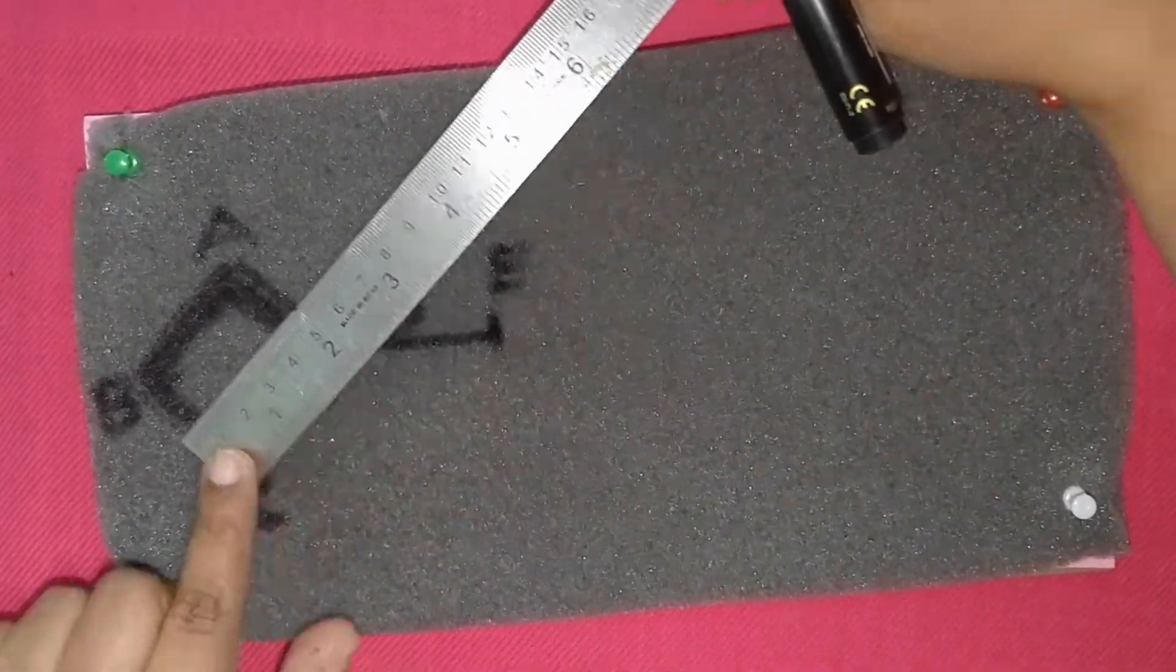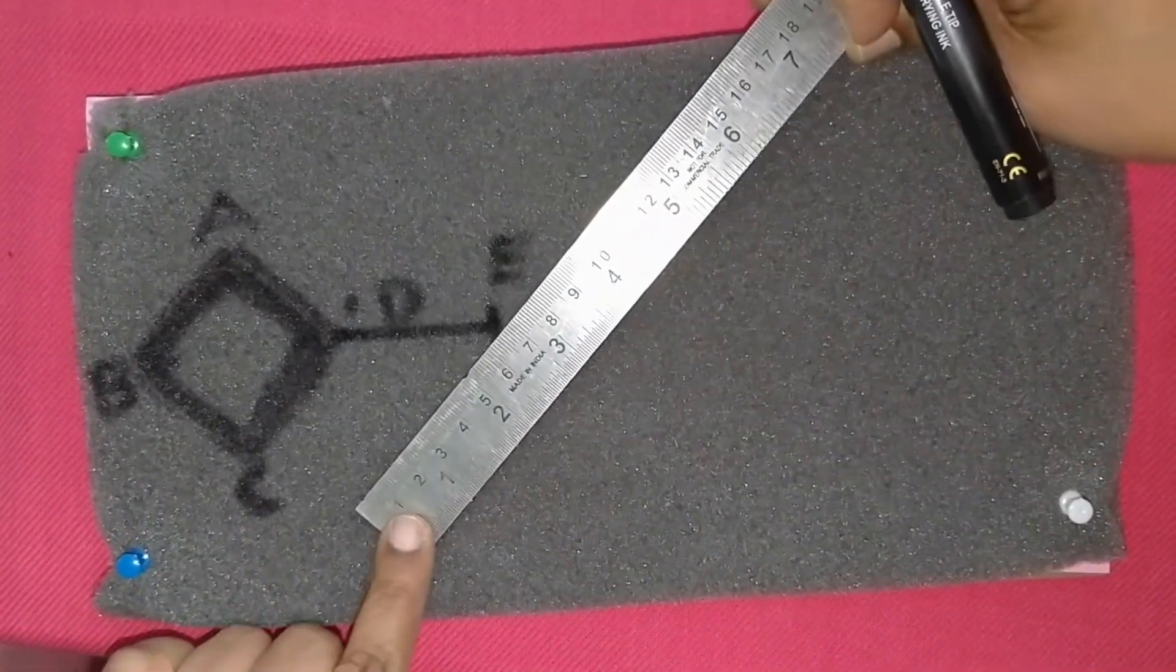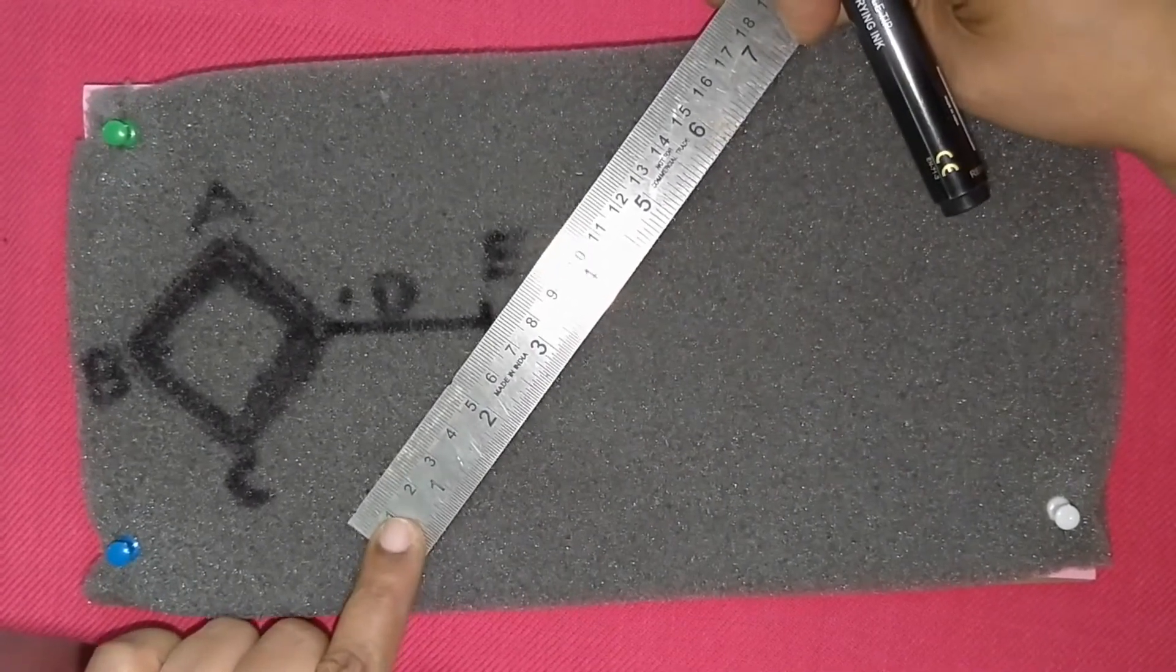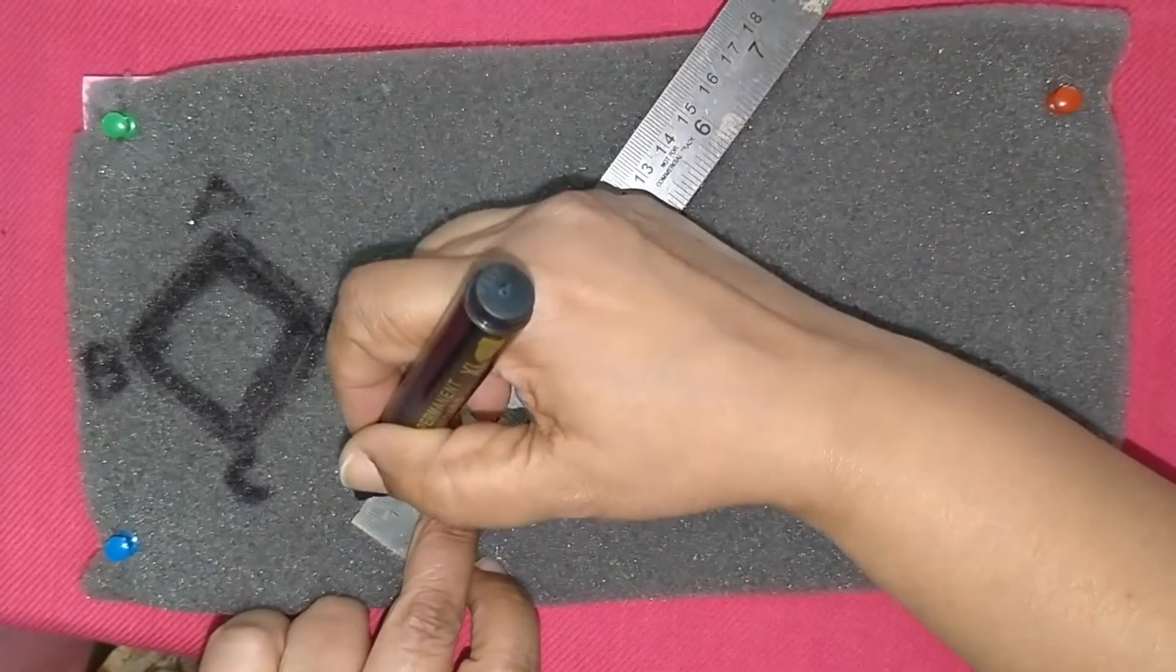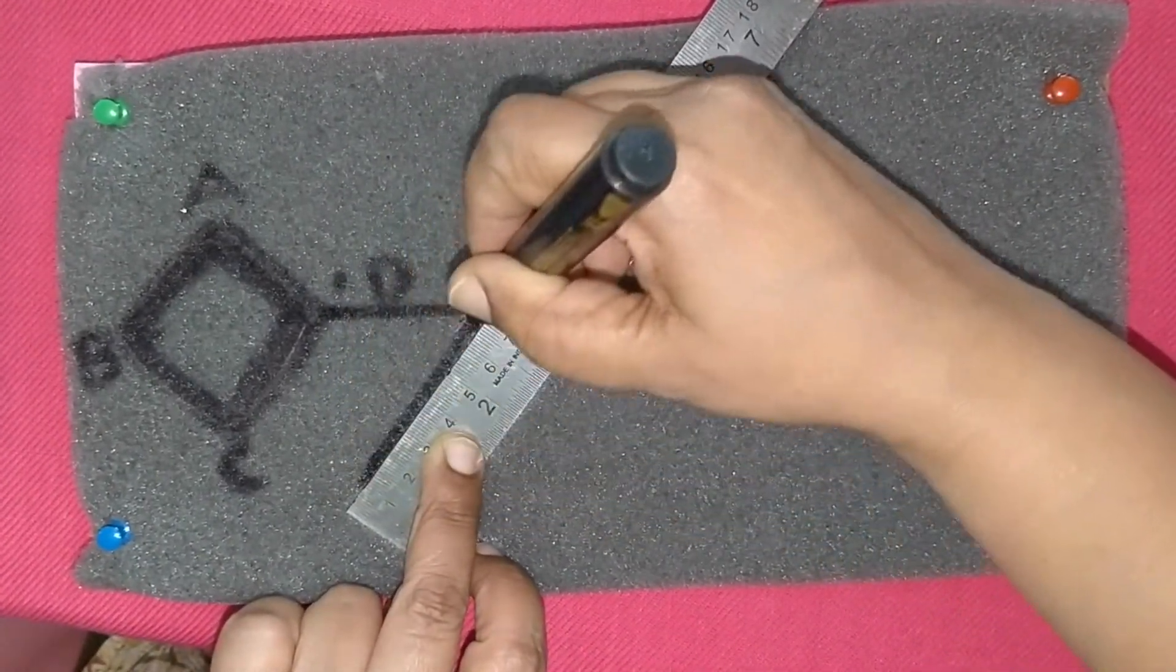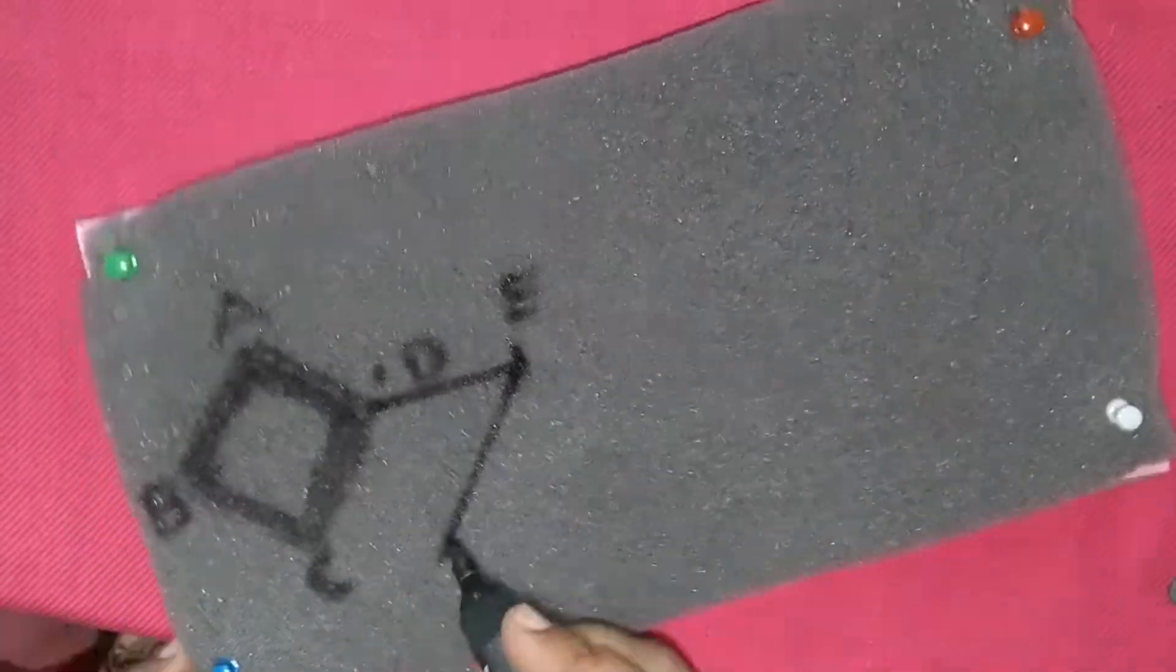Now a line is drawn parallel to the line C, D from the point E. This line E, F will be parallel to the side of the flap adjacent to the defect.